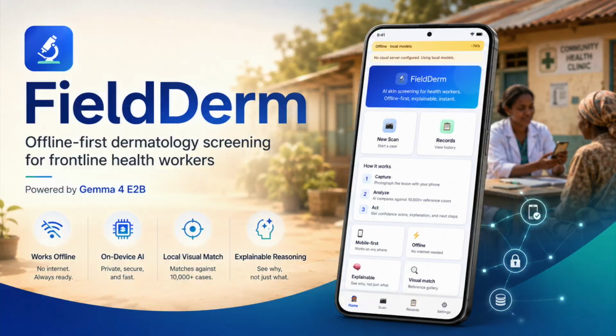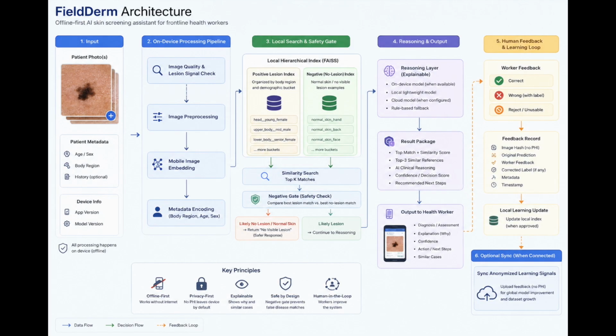As you see in this diagram, the user can upload the patient image, and this image will be on your local phone, running with the local Gemma model. It will check the image quality with some algorithms and custom code, do image processing, create an embedding, and based on the embedding, find matches in the local database. You can hold up to 10,000 pictures in the database and find the top similar pictures and feed them to the model. There are both types of pictures, healthy skin and skin with disease.